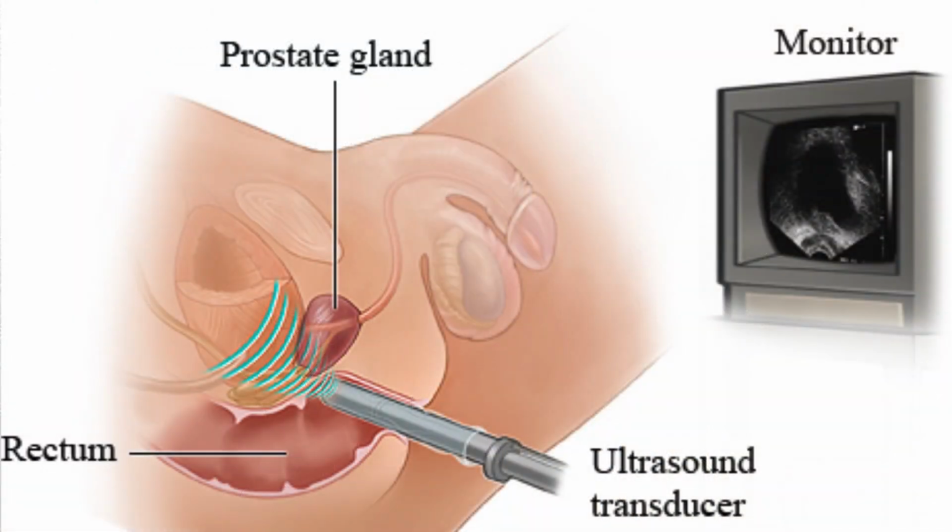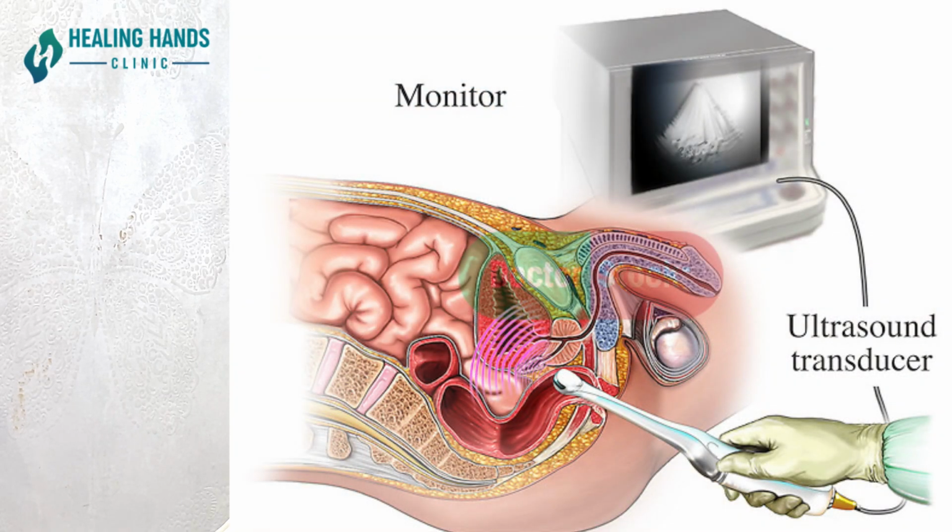Welcome, sir. Hi. First of all, thanks for having me, and it's a pleasure to be here talking about this topic, that is 3D endo-anal ultrasound. What this is, it's a type of ultrasound in which we introduce the transducer, which is the perianal or the endo-anal transducer, inside the anal canal, and then we acquire the images in 3 dimensions, right? In 3 spatial dimensions.